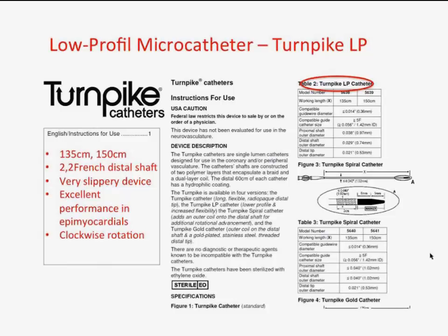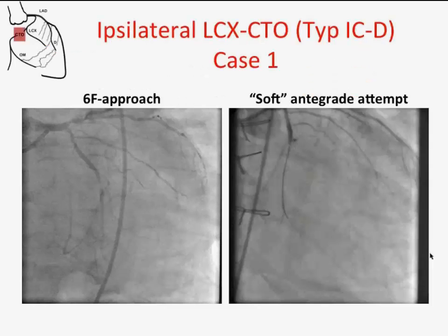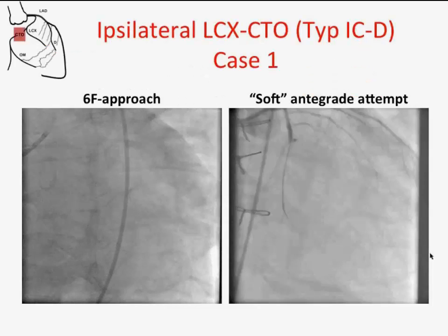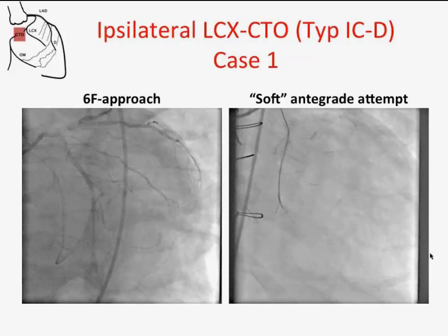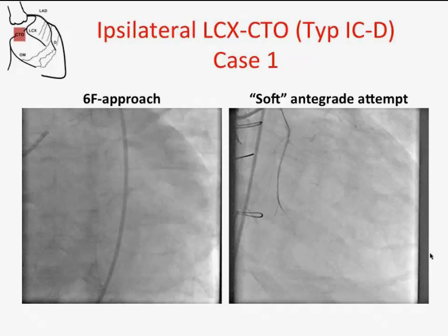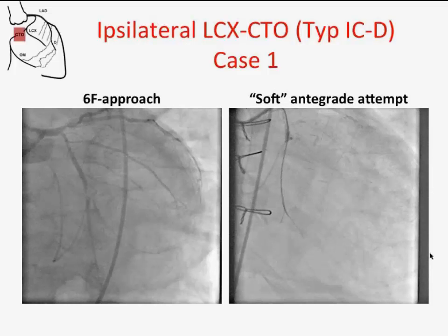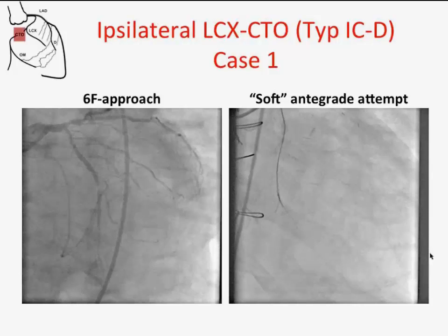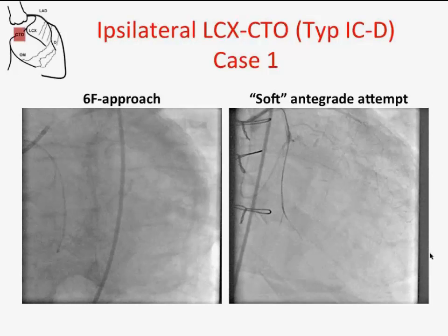So we have a lot of pushability and a very slippery and excellent microcatheter for epicardial approaches. What I show you now is, in December we did a first testing with some other centers. It was a worldwide first test of this microcatheter, and I did 3 cases on this day, and I showed you all 3 cases.